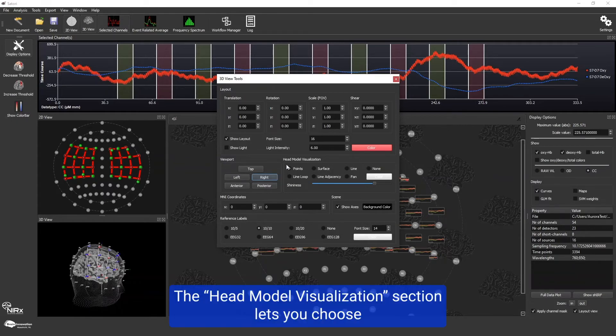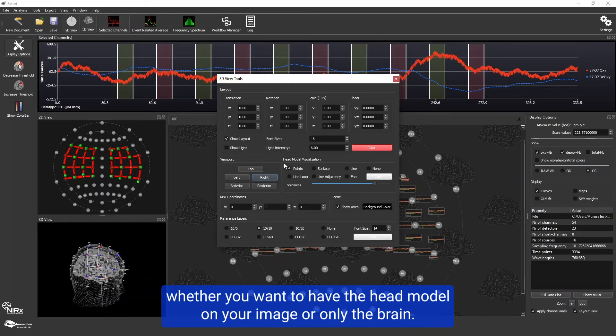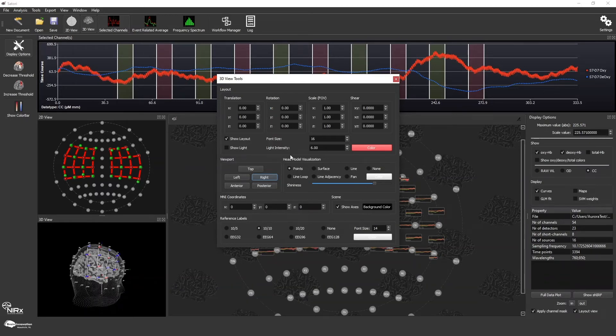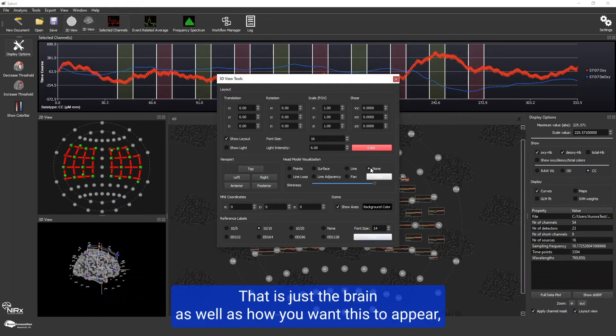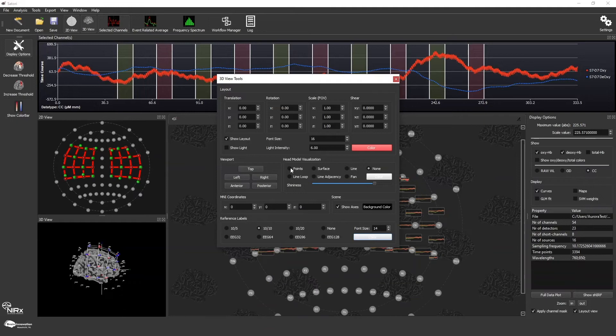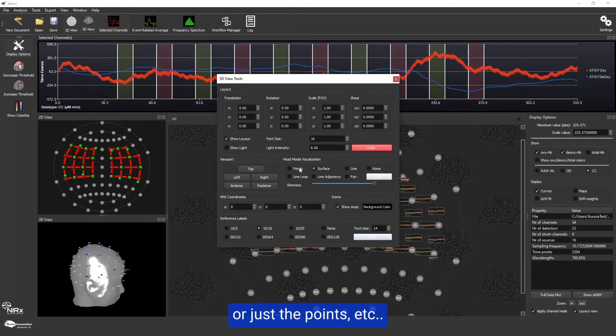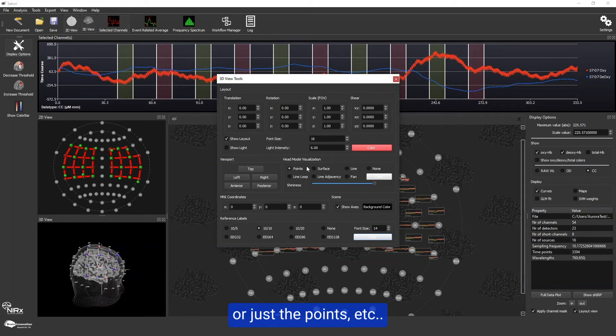The head model visualization section lets you choose whether you want to have the head model on your image or only the brain. Right here, that is just the brain. As well as how you want this to appear, whether with the whole surface or just the points, etc.